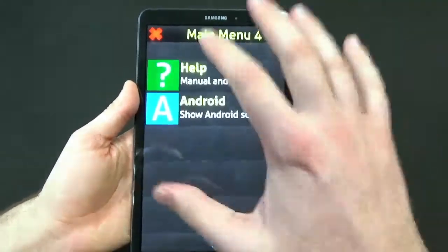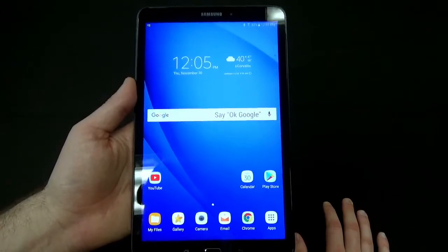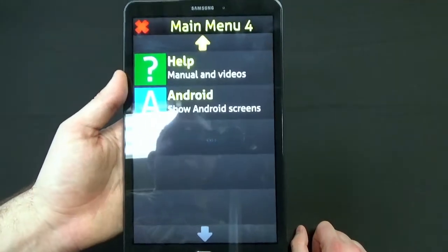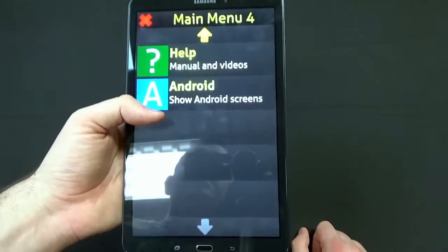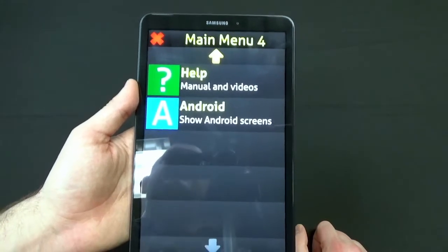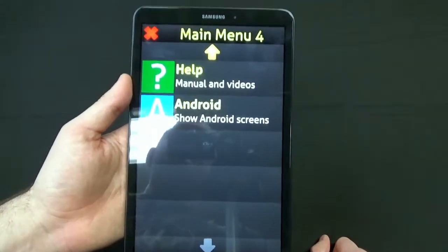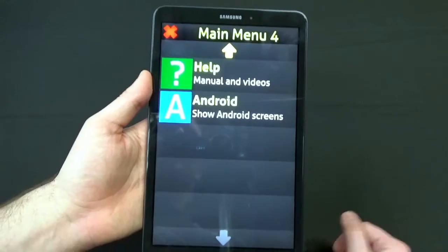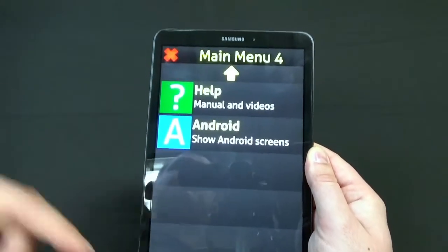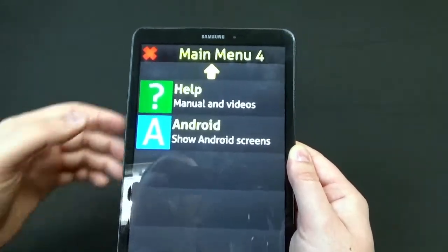One of the neat things about this is you don't have to stay in the Synaptic software if you don't want to. You can exit out to Android and use it like a normal Android device. You can make it so that Synaptic auto-launches when you turn the tablet on, or you can turn that feature off — so if the kids want to use it, you can turn it on as needed. It also has an app launcher so you can launch all Android apps on your device without ever having to completely exit out to Android.